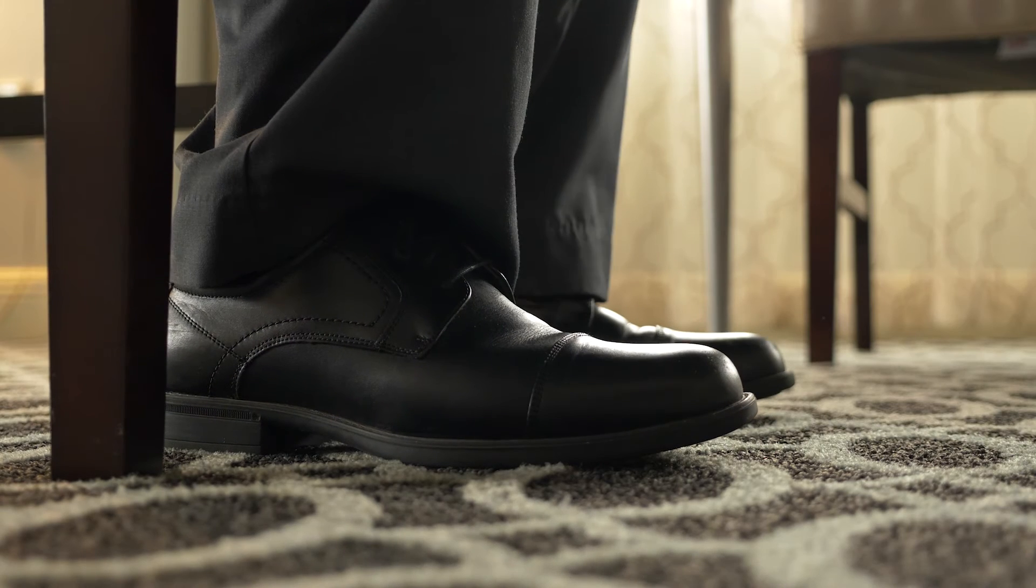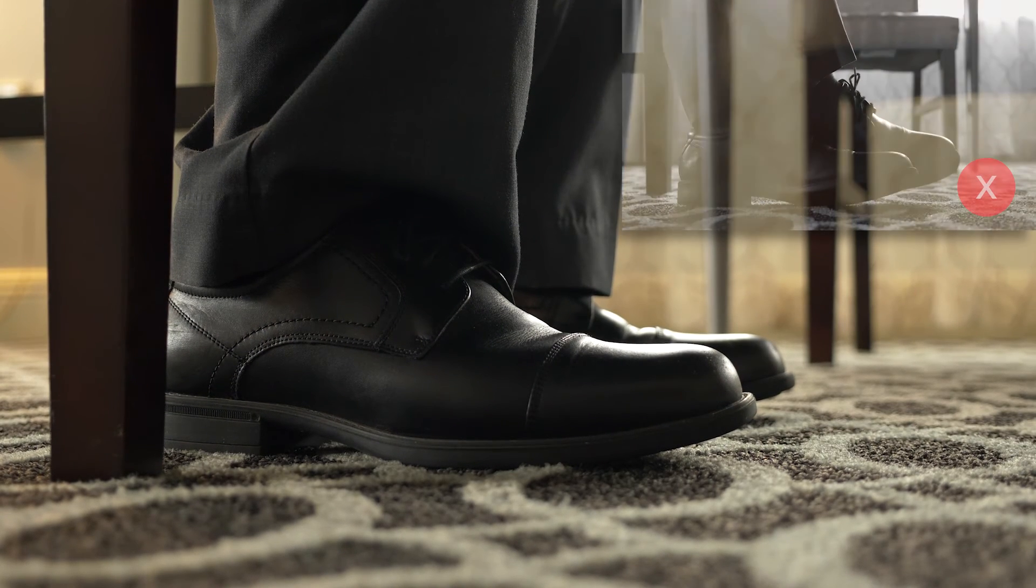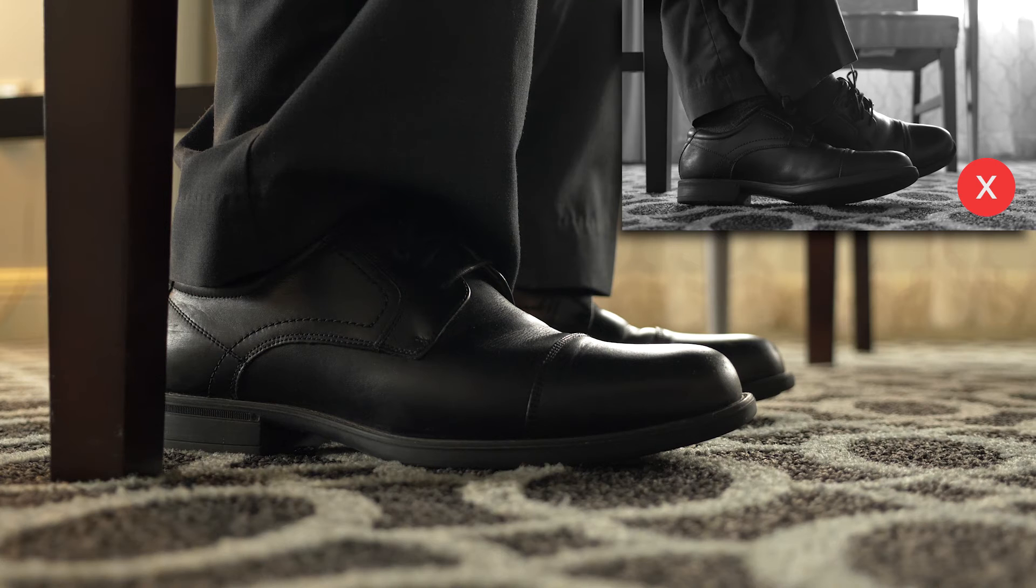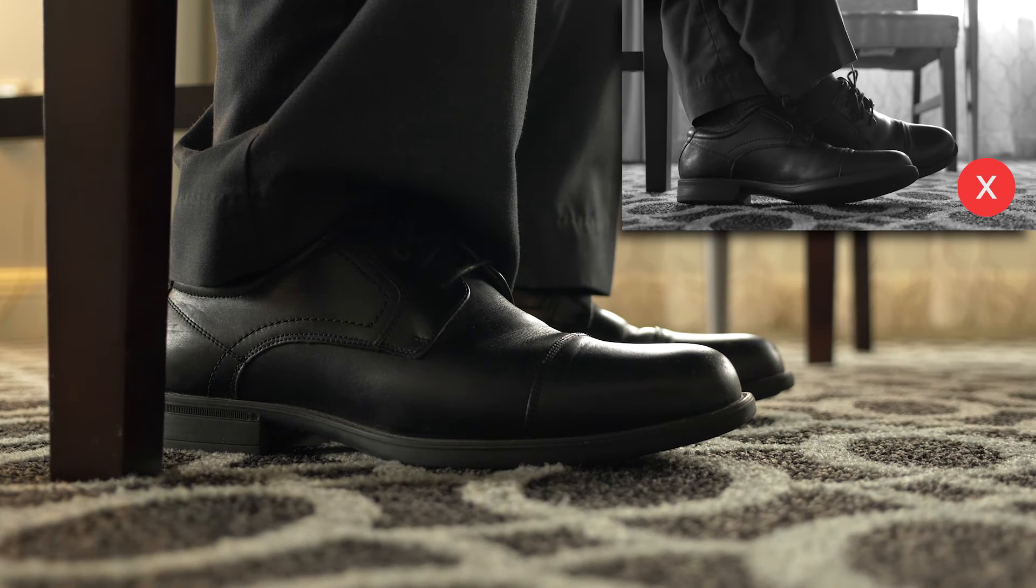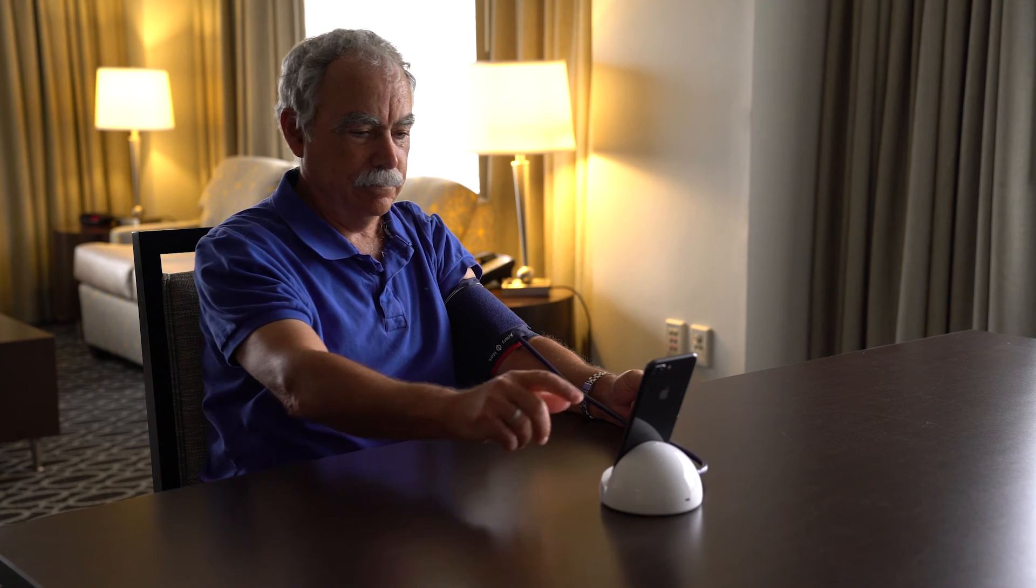When you're ready, place your feet flat on the floor with your legs uncrossed. Lean against the back of the chair and rest your arm on a tabletop so the center of the cuff is even with your heart.